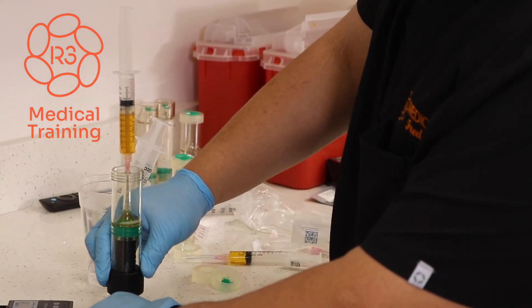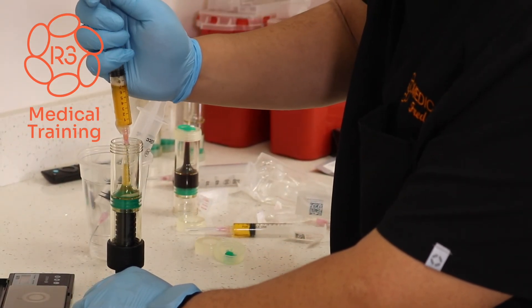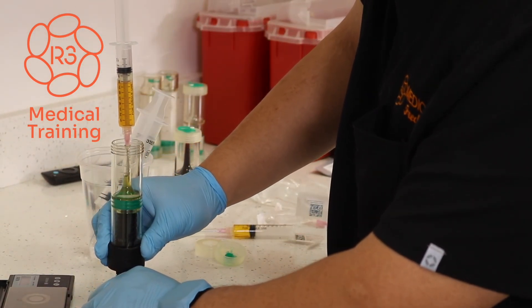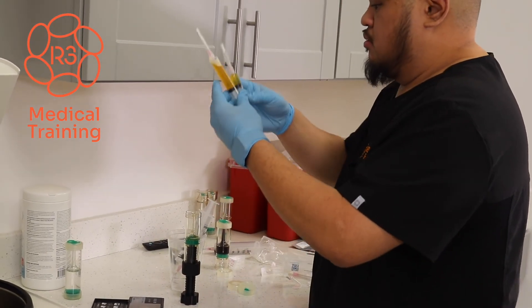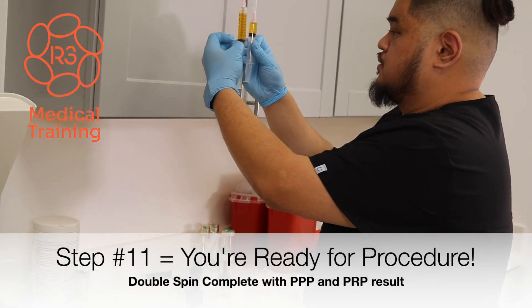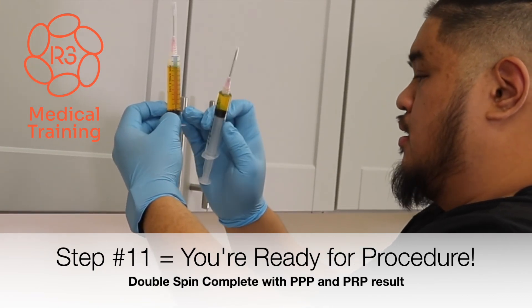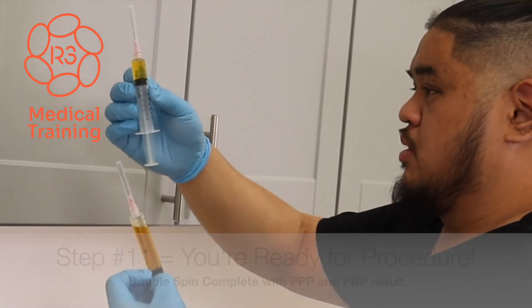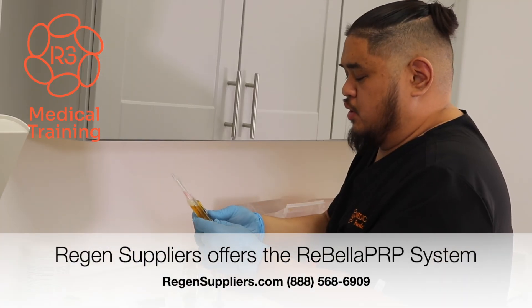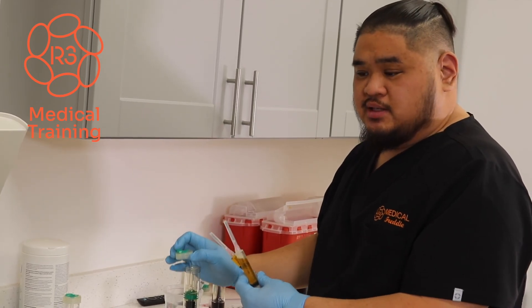If you run out of needle to draw out the remainder, just keep pushing the screw pusher and it will push the remaining plasma up the length of the neck. This will be the PRP that we'll be using. There's a slight difference in color — you see a slight pink tinge, which you want to see. And for the regular PPP, it's that straw colored plasma. From here, we just go ahead and give it to the provider so they can go ahead and continue the procedure with the patient.